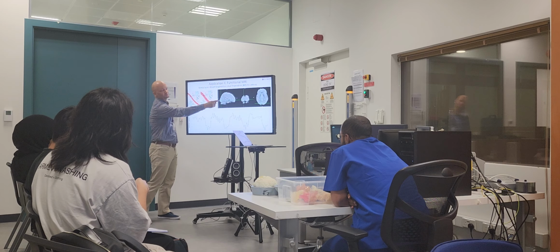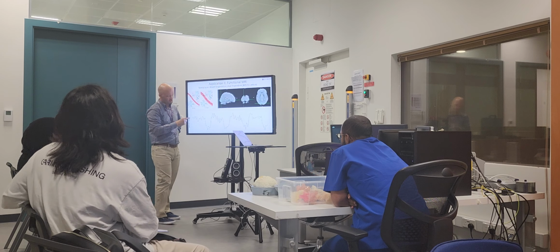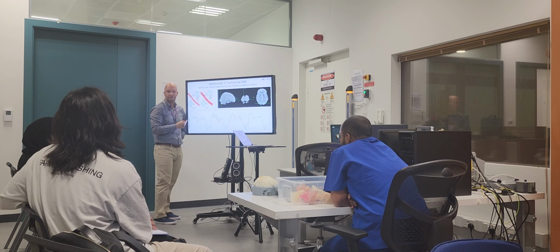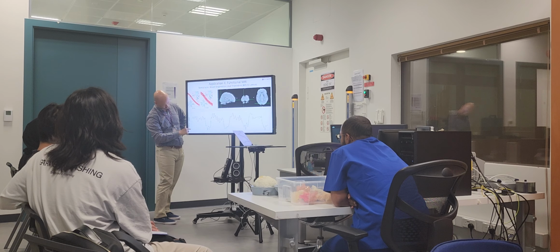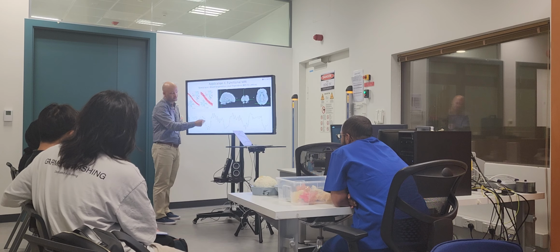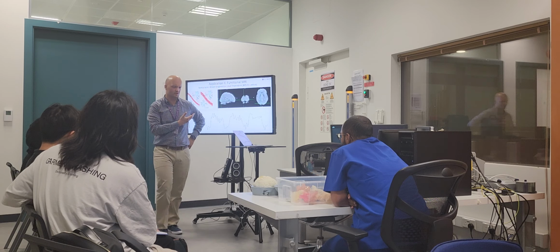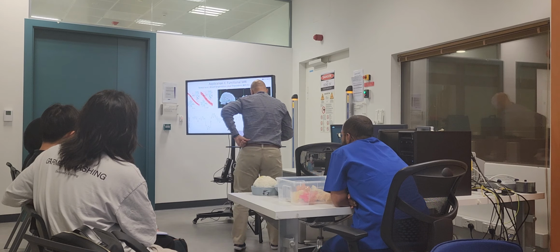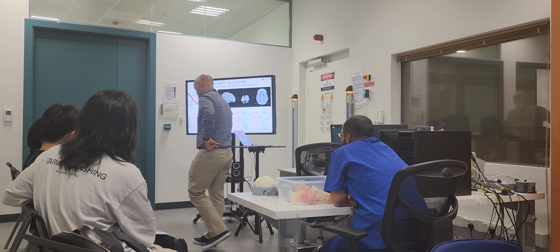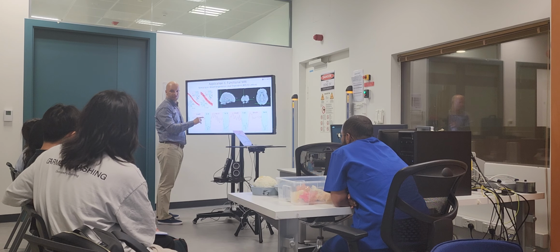I'm just taking that single dot here in the visual cortex on the medial surface. The y-axis is percent signal change. So it goes from 2% to minus 6%, about an 8% drop. Why? What happened? What was this patient doing? She wasn't a patient, she was a nurse at Cleveland Clinic. She was breathing normally for 40 seconds and holding her breath for 15. We told her what to do.